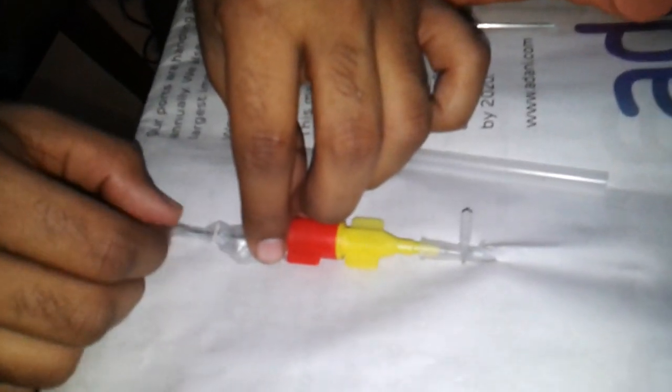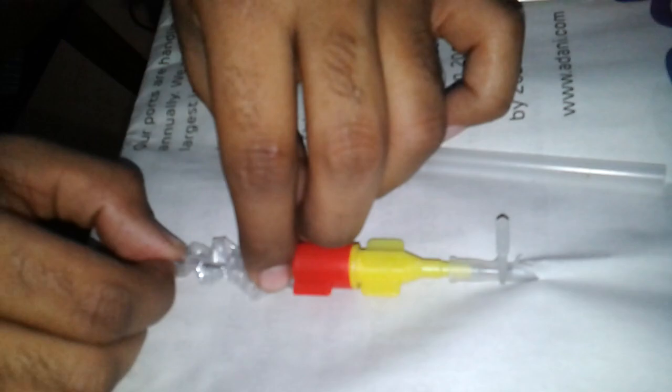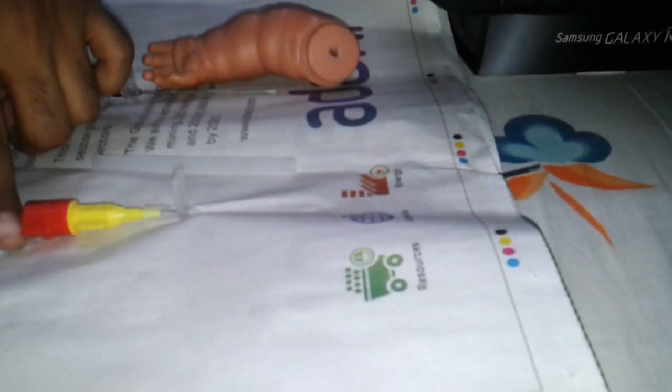Once the blood is there, I remove the stilette and simultaneously put this inside. Then I push the hollow tube all the way inside. Slowly you will see that this wire comes out. What has happened is — imagine this wire is going inside the vein and it will reach near the heart.